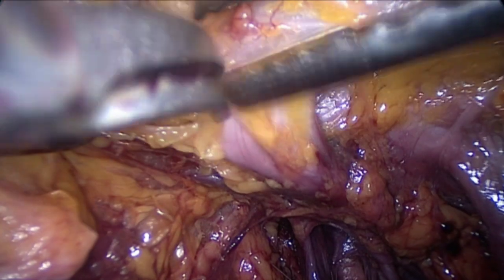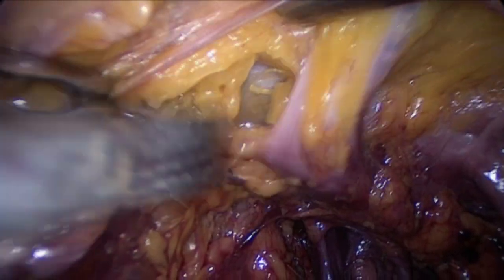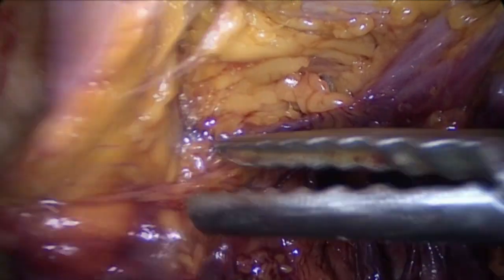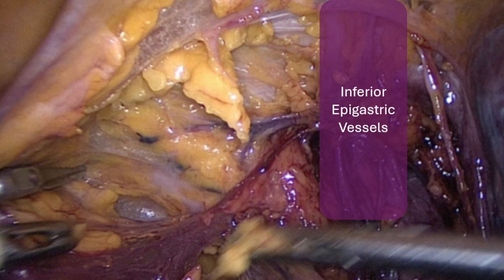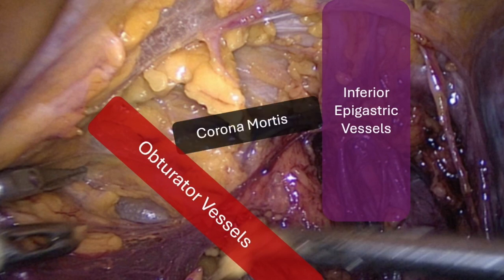Next, let's incise the peritoneum overlying the inferior epigastric vessels and dissect medially from the inferior epigastric vessels at the level of Cooper's ligament. Here we might find something dangerous and unexpected. So let's identify our landmarks. We can see the inferior epigastric vessels, the obturator artery medially, and this anastomosis called the corona mortis, or crown of death, which runs medially and inferiorly along Cooper's ligament.